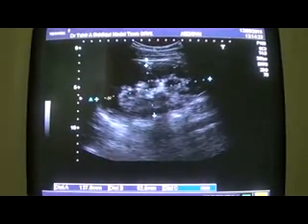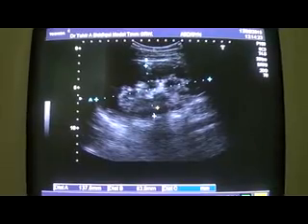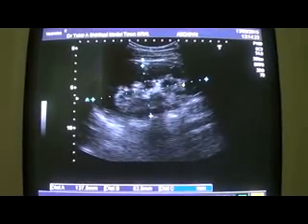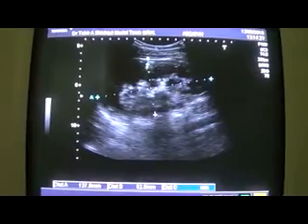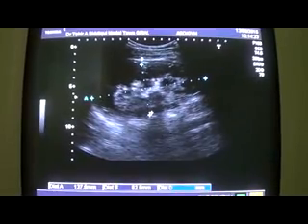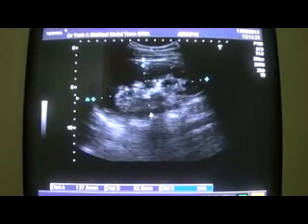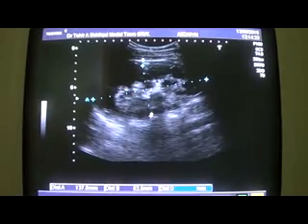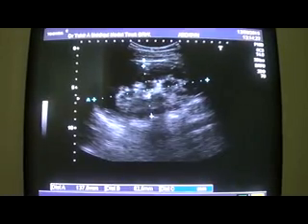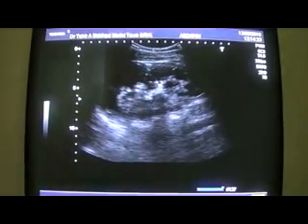Now the length is increased as well as the anterior-posterior diameter is raised, because 11 centimeters is normal for the length. Patient's kidney length is 13.7, and the most important one is the anterior-posterior diameter, that does not change with racial differences or the height of the patient. So this is 6.2, that of the patient, whereas an anterior-posterior diameter exceeding 5 centimeters is considered enlargement. So this is the first thing to be noted in this frozen image.